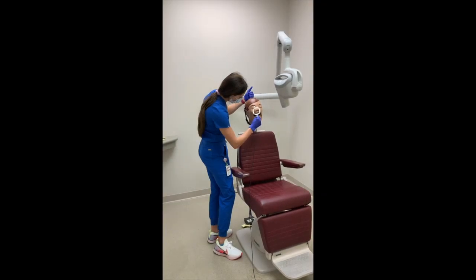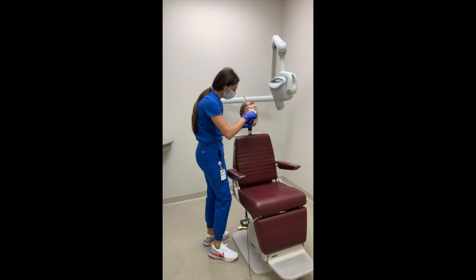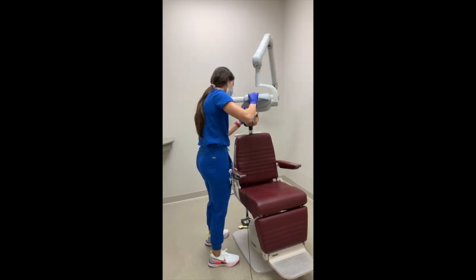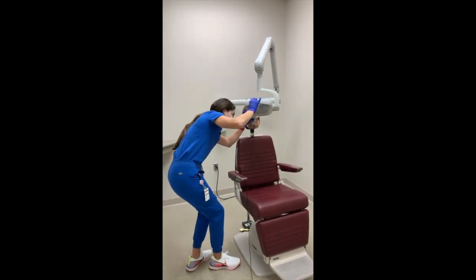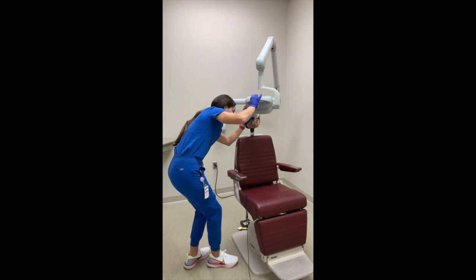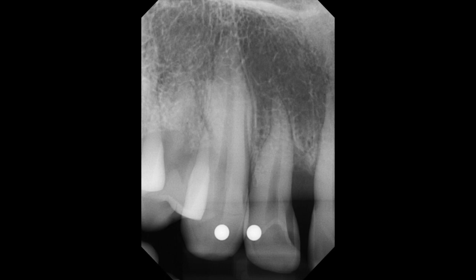In order to correct this, the student needs to foreshorten the image of the tooth onto the sensor. To do this, we will aim the x-ray beam at an exaggerated angle. First, lift the x-ray tube head up. Next, aim the PID down at the sensor at a steeper angle over the top of the apex. Upon review, the image shows the entire length of the tooth, including the apex and surrounding bone.